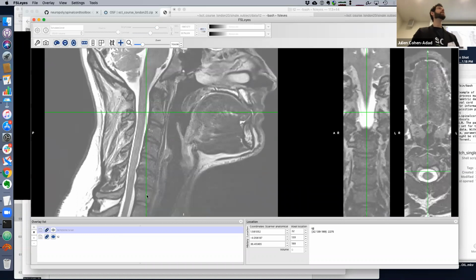I have a question. Yes. You said that you have used the spinal cord template and the brain template. At what step does this make a difference? Yeah. So far the studies that included both the brain and the spinal cord started by doing a guillotine type of action, separating the head and the spinal cord, and doing those two pre-processing steps separately.